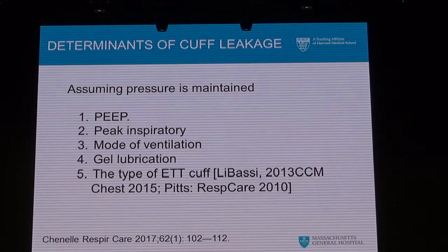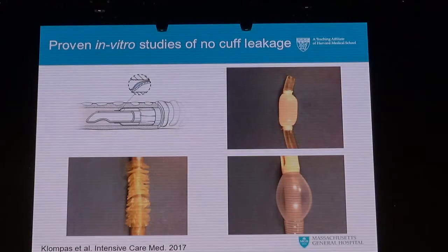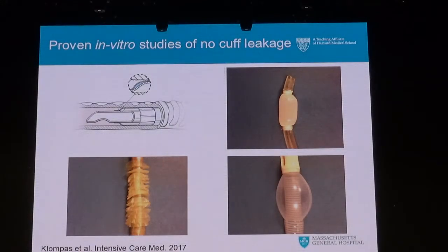The only problem with that is that it lasts only a few hours. So if a patient needs to be ventilated for long days, then it doesn't help. Only 4 cuffs at this time are really available. Actually, 3 of those cuffs are not commercially available, but only these 4 cuffs showed absence of leakage around the cuff. These are the only 4 that really exist.